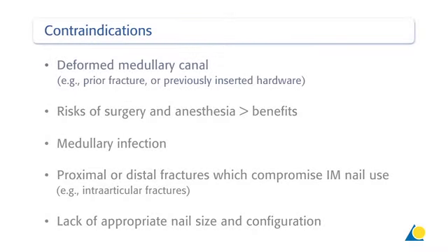Contraindications include a deformed medullary canal, for example resulting from prior fracture or previously inserted hardware, patients where the risks of surgery and anesthesia exceed the benefits, medullary infection, proximal or distal fractures which compromise intramedullary nail use, such as intra-articular fractures, lack of appropriate nail size and configuration.